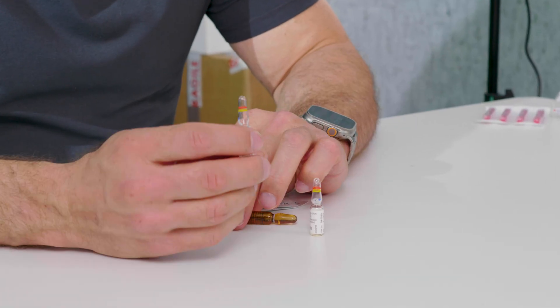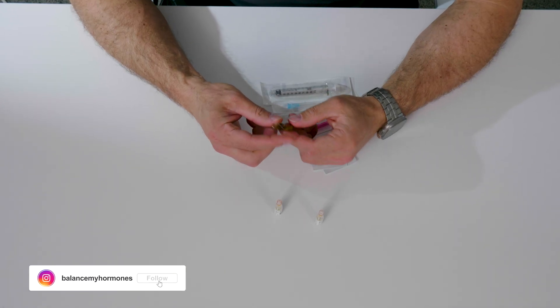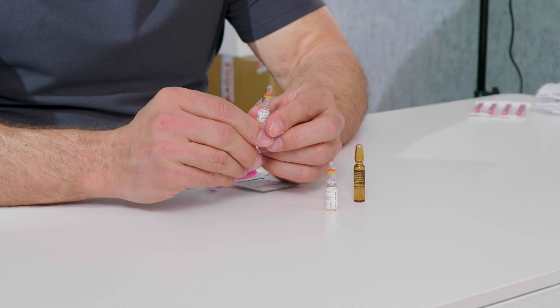Then have a look at the ampule and look for a blue dot if that is on your actual ampule. This other ampule I have here does not have a blue dot. As a guide, I find it easier to just locate where the writing is, have the writing facing me, and then follow with the motion where I break it away from myself. If you have a blue dot on your ampule, have that blue dot facing yourself.